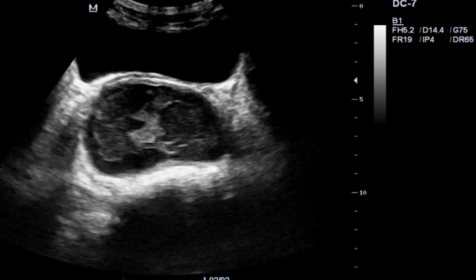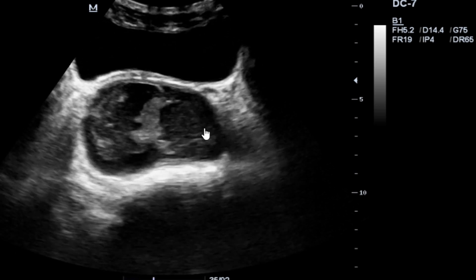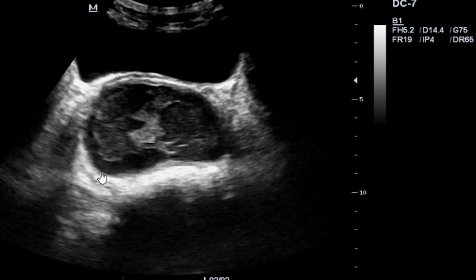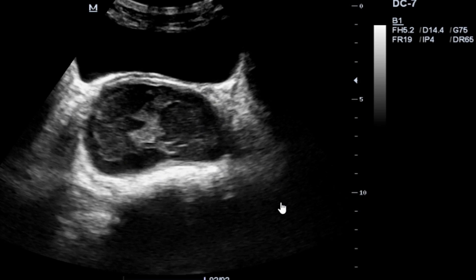At our radiology department, we hardly come across these types of conditions. Since I started working here, this is the first time I saw this. You can see the urinary bladder, and then we have a separate collection with no communication between the urinary bladder and this collection — so we could not suspect a diverticulum.